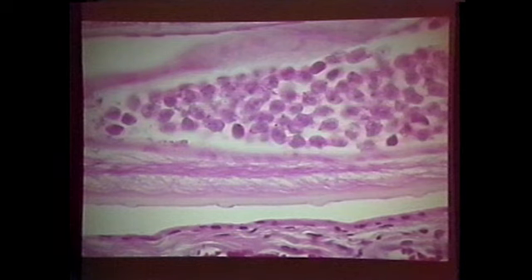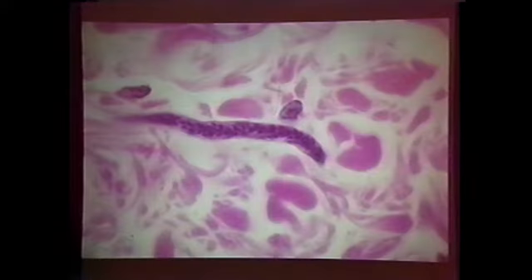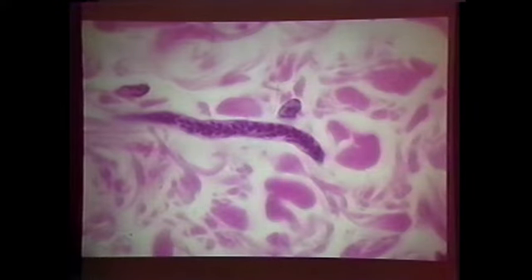We want to know, does the microfilaria go out into the collagen, into the skin of the dogs, so we can try to use topical anthelminthics to cure the disease? And by happen, it does. This is a microfilaria. So now, if we can decide which species it is, we have the answer.